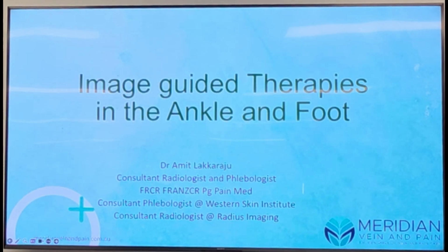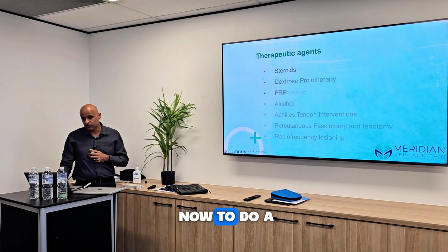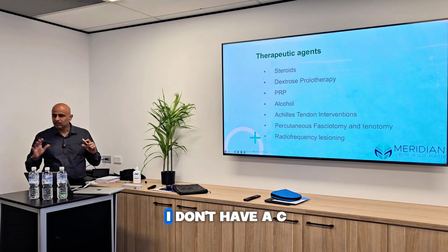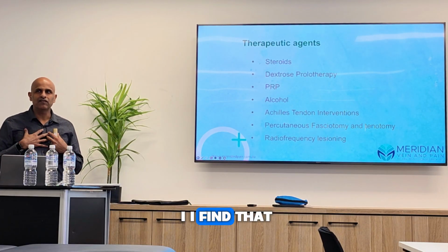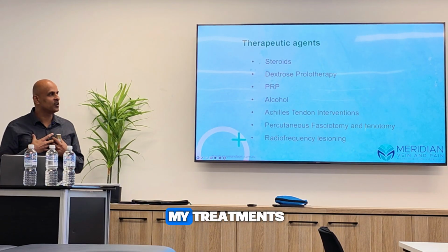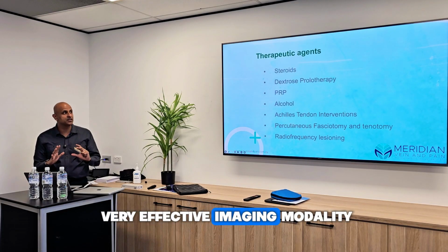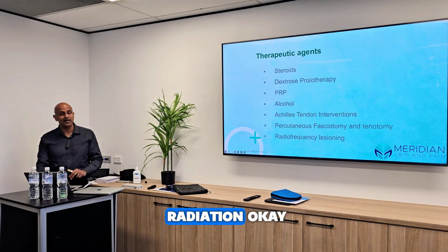So what do we do? Well, I use primarily ultrasound now to do a lot of my treatments. I don't have the luxury of CT. I don't have a C-arm. But really, in my practice, I find that for about 99% of all my treatments I can use ultrasound. So that's the power of ultrasound now. It is a very, very effective imaging modality, much more so than other modalities, without the issues of radiation. Okay.